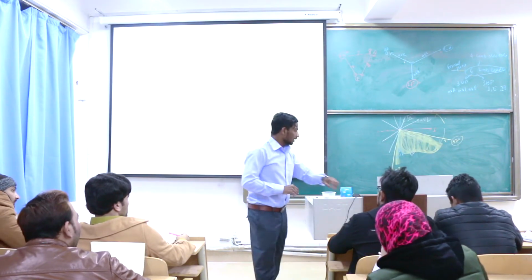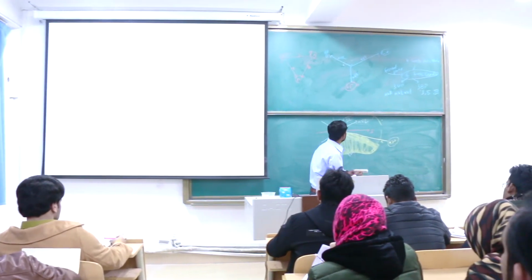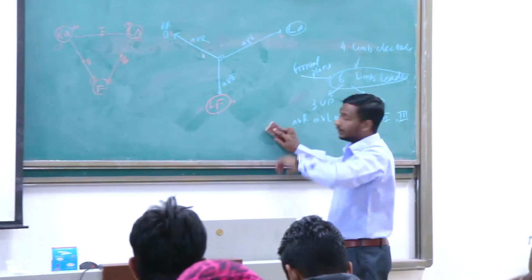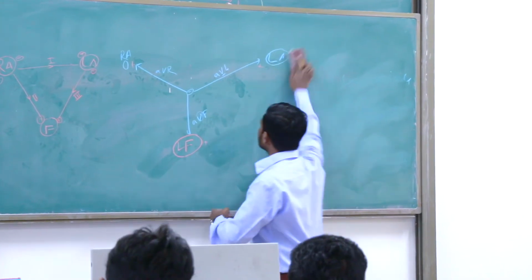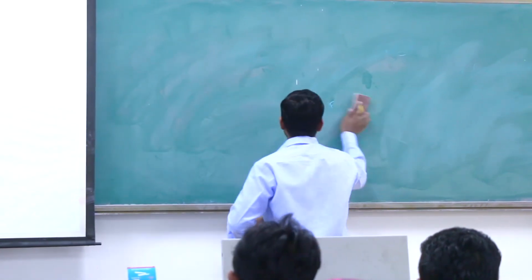Right? And this V1 to V6, let me just remove this one here and then we can see more clearly. So, can I erase this one now? Yes. Give me an example of bipolar limb leads. 1, 2, 3. And the unipolar limb leads?